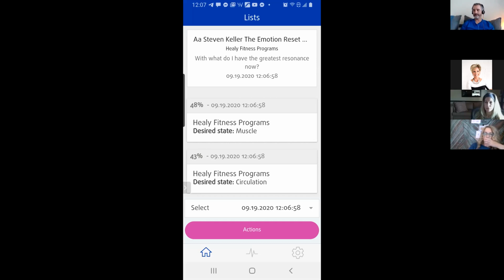Makes it super convenient. So if you're trying to do this on a kid, right? If it's a little kid, you might dress him up in pajamas or something and zip him up so he's all hooked in, and then run some programs on him, or long sleeves, different things like that are some recommendations.